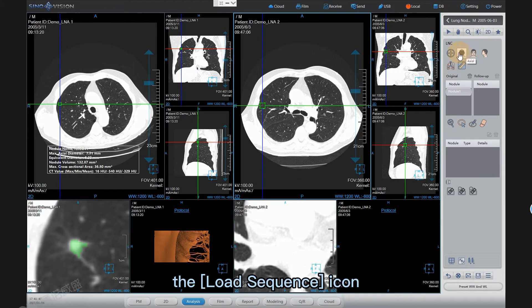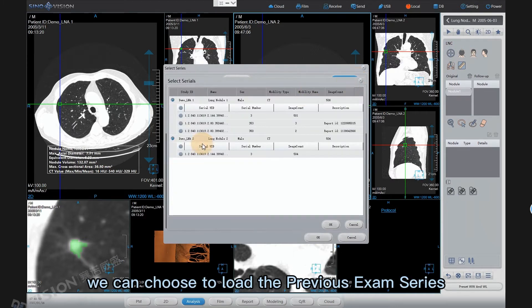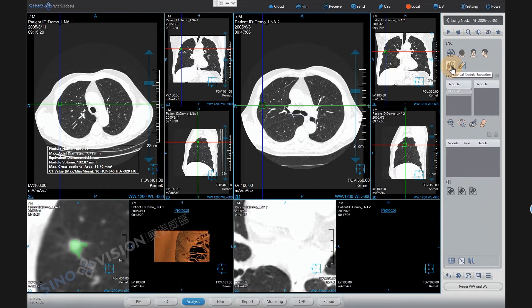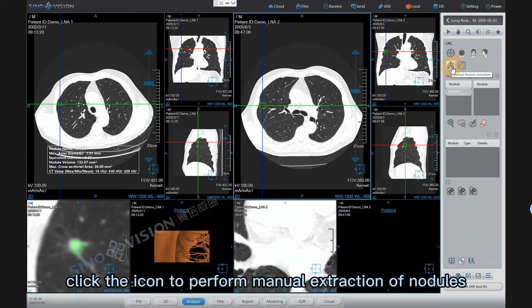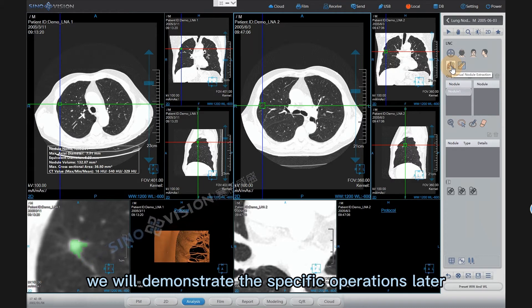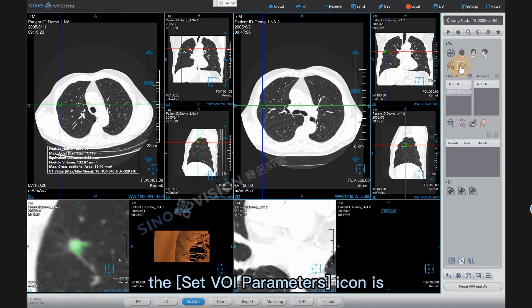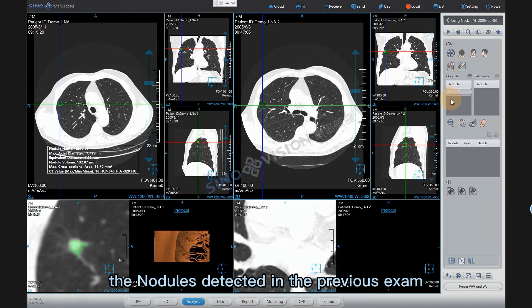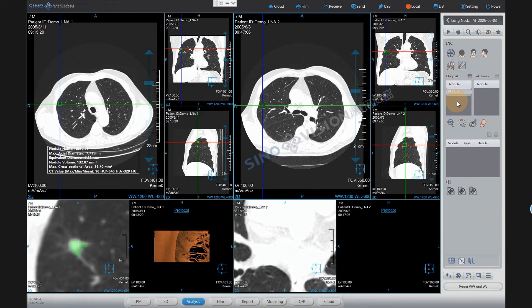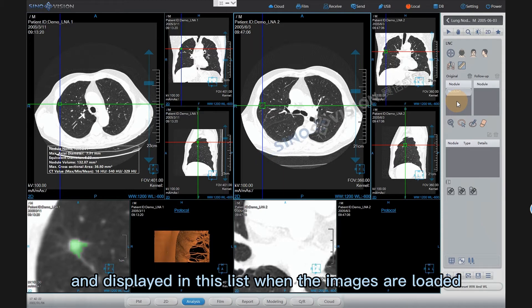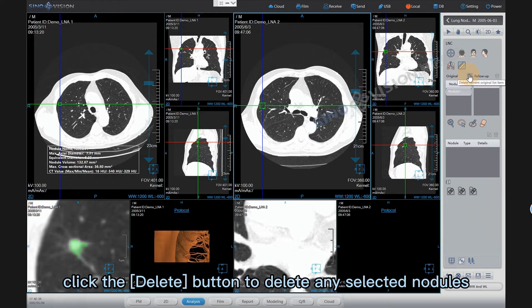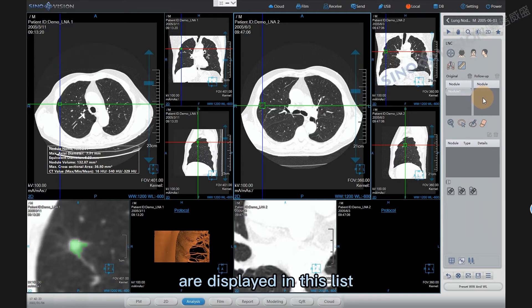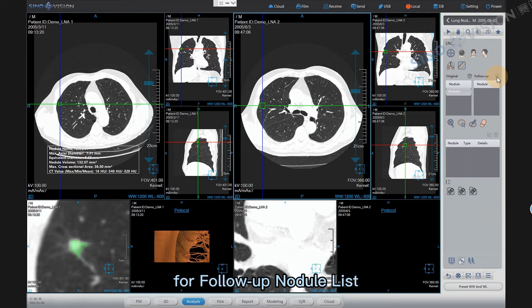The load sequence icon allows us to choose to load the previous exam series and the comparison exam series. The manual nodule extraction icon, when clicked, performs manual extraction of nodules. The set VOI parameters icon is for setting the size of the bounding box. The original nodule list displays nodules detected in the previous exam, which are automatically identified and displayed when images are loaded. Click the delete button to delete any selected nodules. The follow-up nodule list displays the manually extracted follow-up nodules, with the same delete function.